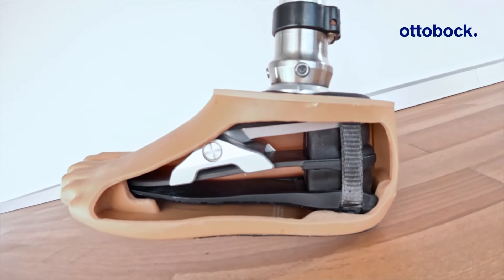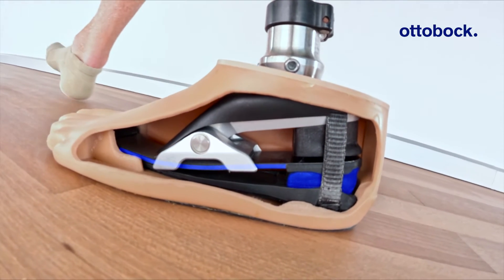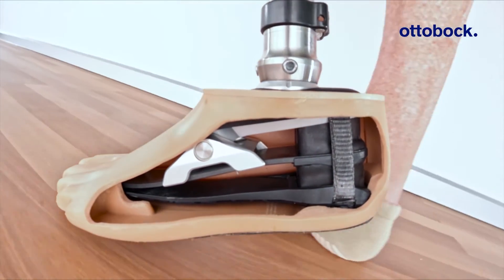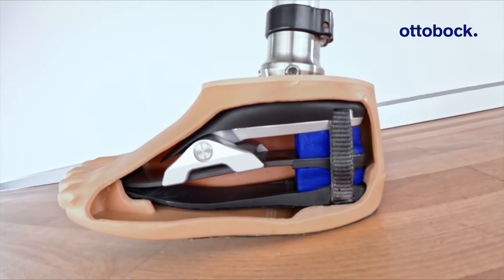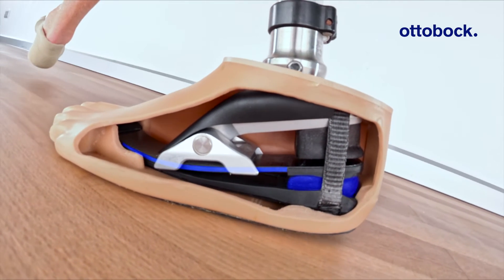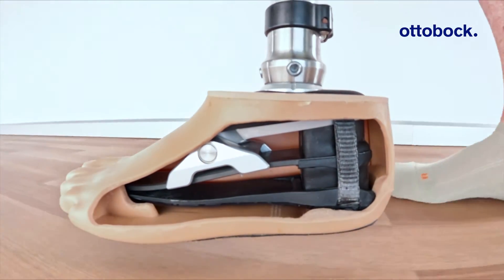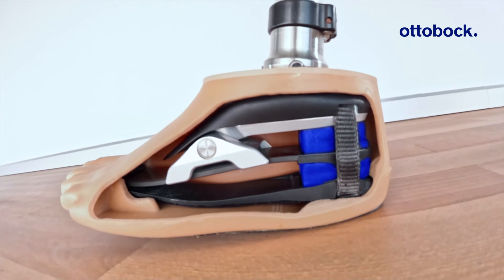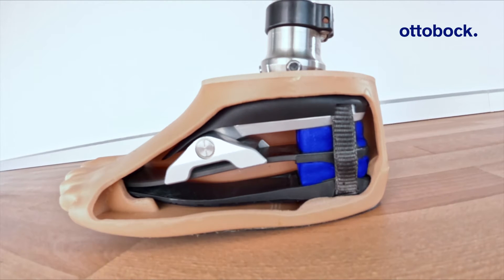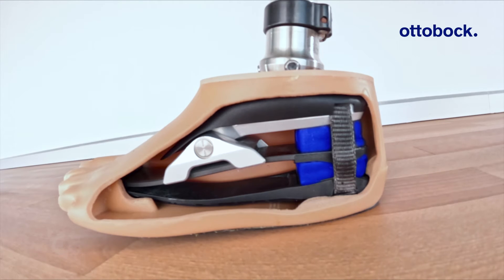Here we see how the carbon spring and the ankle joint interact with the two high rebound foam wedges in the heel. The blue color shows the energy uptake and the green color shows the energy release. At initial contact, mainly the top heel wedge compresses and stores energy. This provides a very smooth heel strike with shock absorption, enables plantar flexion, and the controlled transition to mid stance.